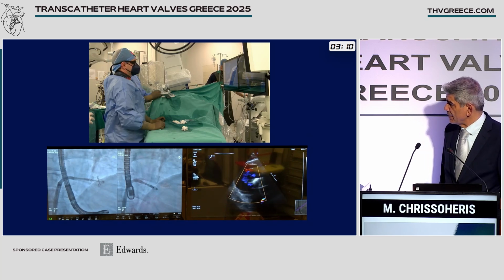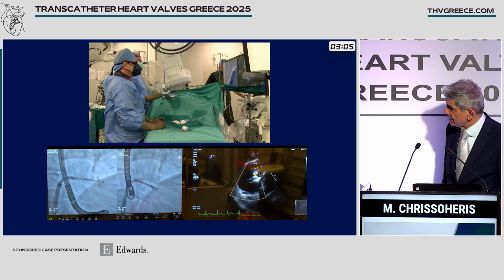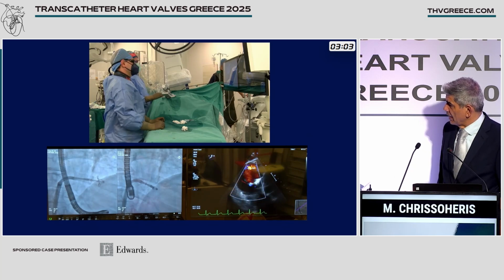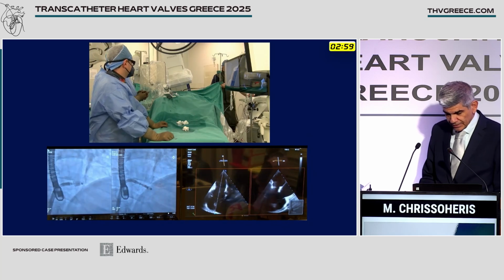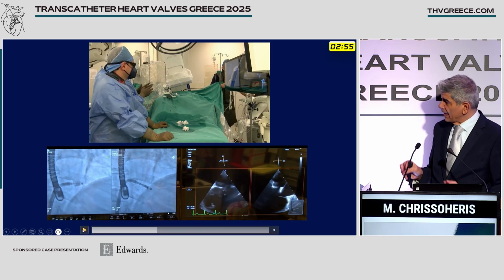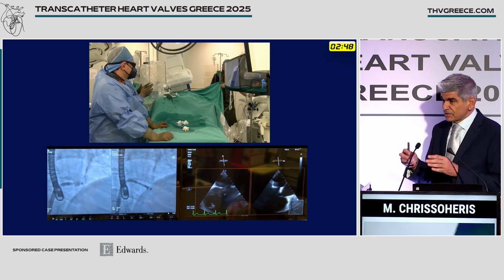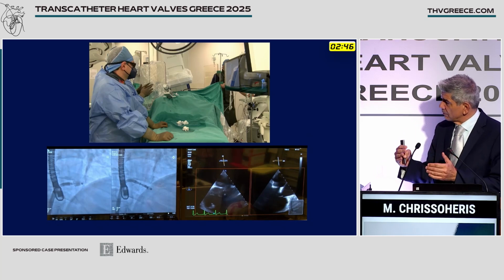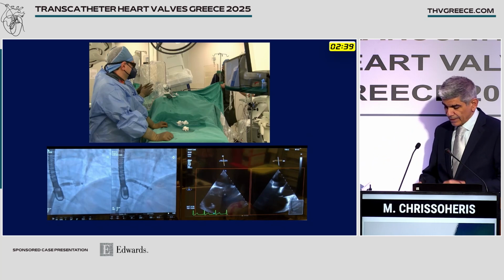We're fairly deep in the septal commissure, and we're not really doing much to change the color of this valve. So with that, we changed our strategy at this point because our goal is always to get a good result with the initial device. If we don't get a good result, then we have to change our strategy. And because there was a lot of color at the center and posterior of the valve, we changed our strategy to go with this device more central posterior septal.